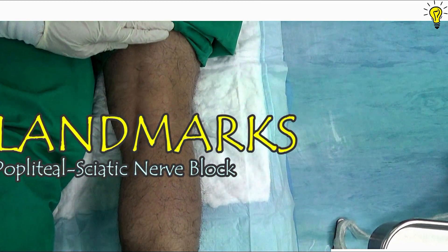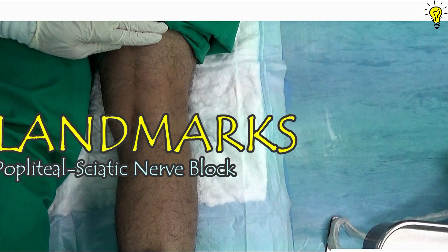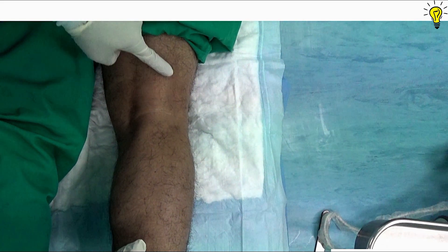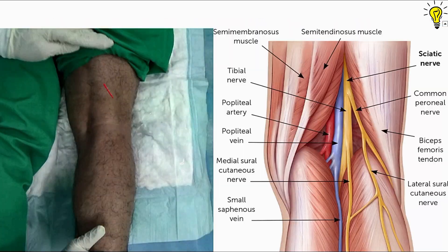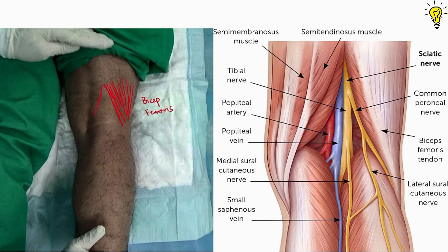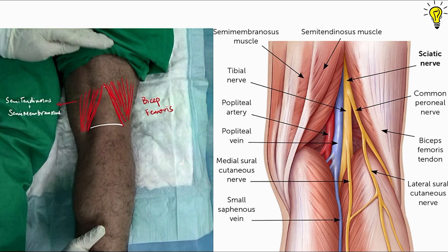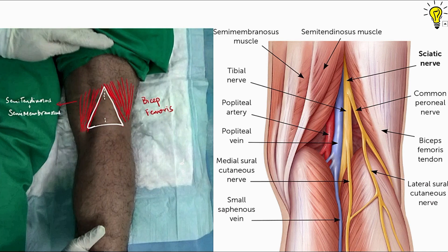Now the anatomy and landmarks for popliteal block. Placing the patient in prone position, I ask the patient to flex the knee against resistance of my hand — this makes the popliteal triangle visible and the main tendons are apparent. On the lateral part, the huge bulky muscle is biceps femoris; on the medial side we have semitendinosus and semimembranosus. The base of the popliteal triangle is formed by the popliteal crease, and the apex by the junction of the two big muscles. The needle entry point is 7 cm above the midpoint of the popliteal crease and 1 cm lateral, because the sciatic nerve comes in slightly lateral, more under the biceps femoris muscle.